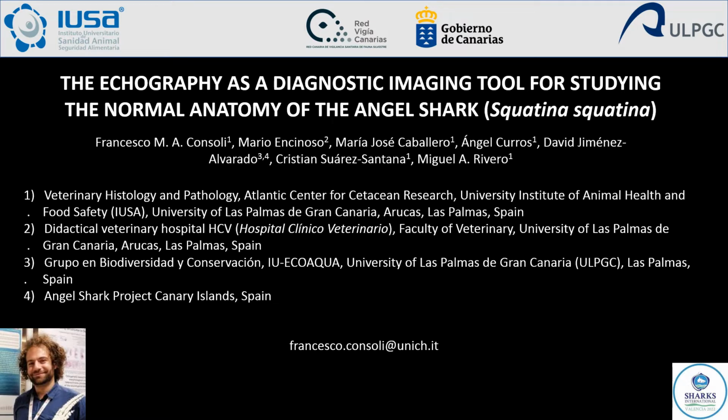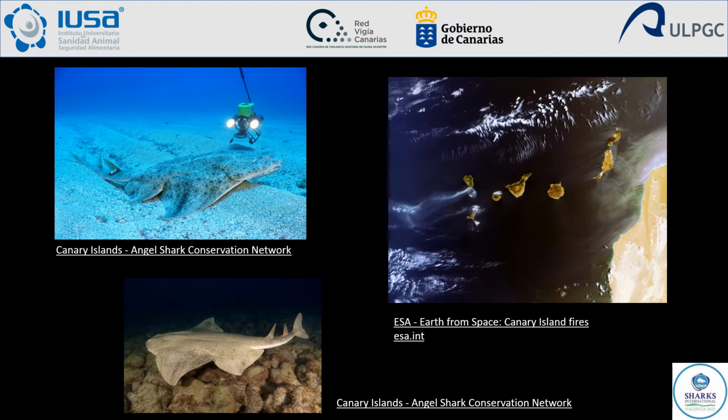I will talk about the anatomy of the angel shark through an ultrasound imaging technique. In this study, our group has collaborated with the Angel Shark project in the Canary Islands. The angel shark has been assessed as critically endangered by the IUCN Red List, and the Canary Islands archipelago is considered a very important refuge of one of these species, Squatina squatina.